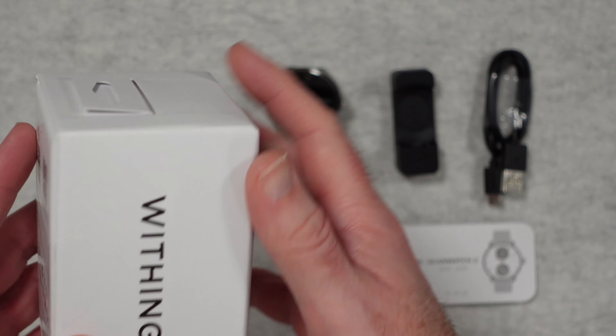Before we take a look at the box contents and the features, just a little bit of background. I really do love my watches — I own many a watch, some of them are automatic, I own a few smart watches as well, a few quartz watches. This one is a great mix and it really has intrigued me.